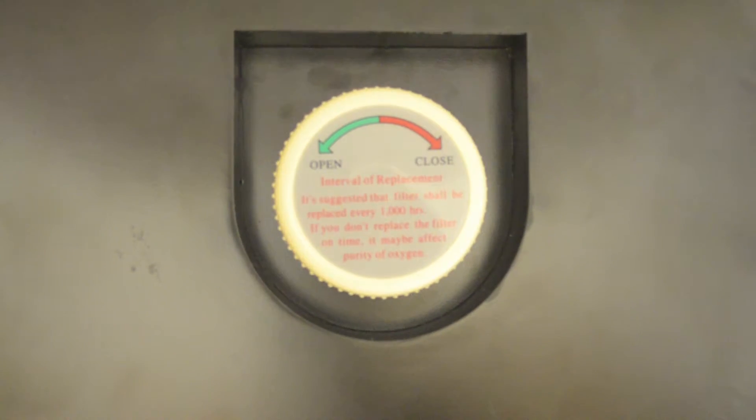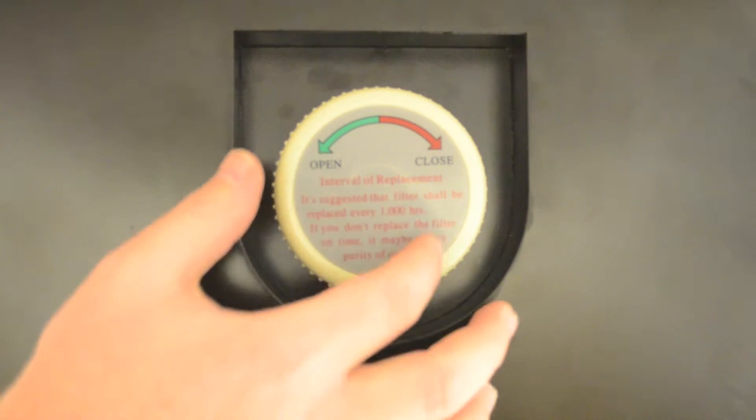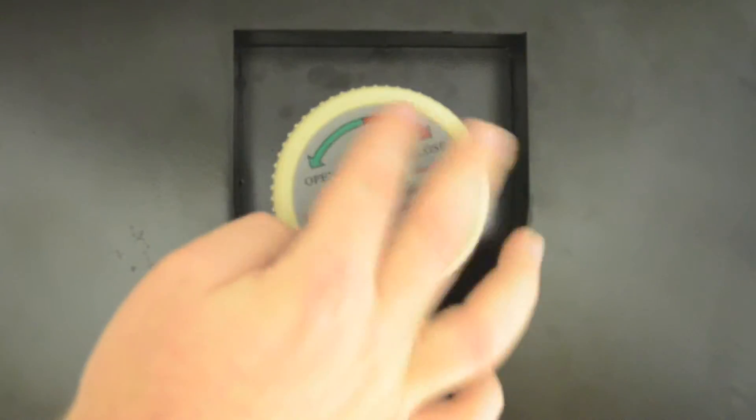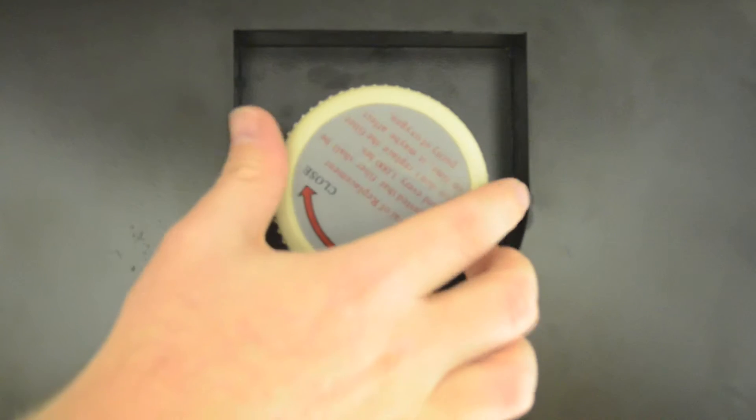The intake filter for the Eris Oxygen Concentrator is located on the left side of the unit. Remove the filter cover and replace the filter as shown.